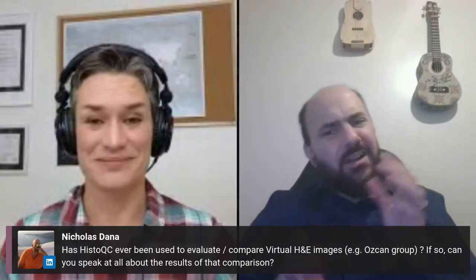I think you're going to give me different answers for the same slide if I space it out over 3 months, right? Because you're going to be influenced by the slides that you just saw that day. So if I waited till the end of the day, you'll say, oh, but I don't remember the ones from 3 months ago. Now, we don't have to do that. I'll say, oh, it's 0.374. It's still 0.374. If you want to change the cohort, we can give you an updated estimate of how dissimilar or similar it is to that.